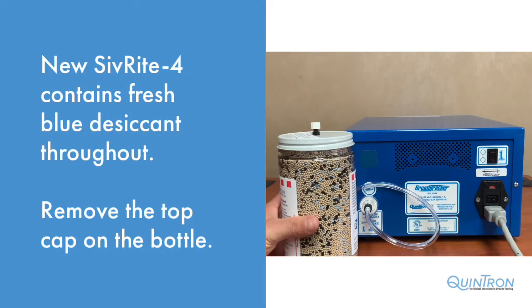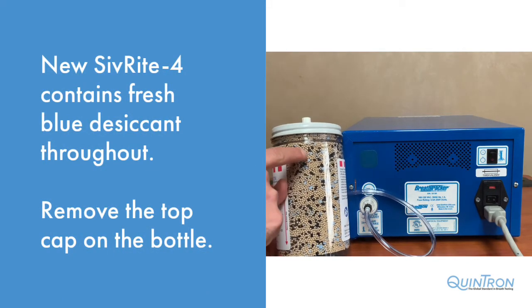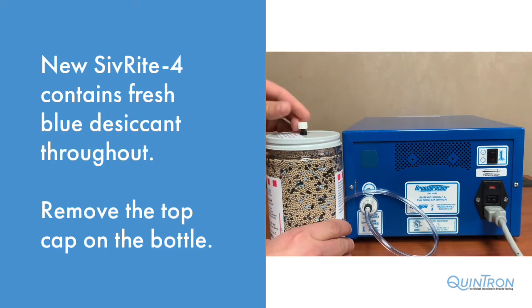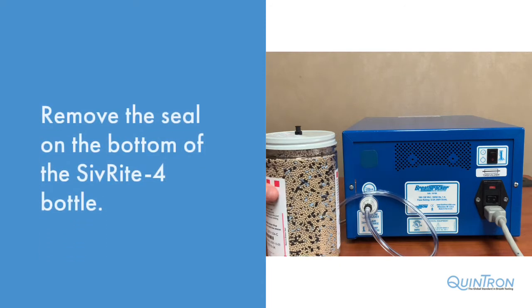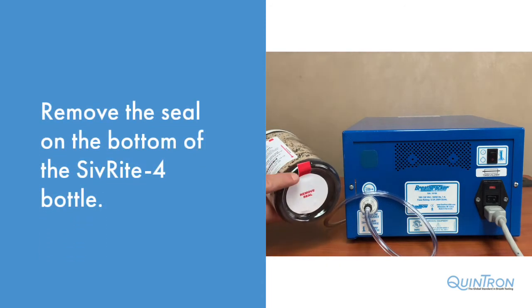As you can see with a new Sivrite 4 bottle, the desiccant material within is blue throughout. Remove the small cap on top of the lure of the Sivrite 4 bottle. Then remove the seal located on the bottom of the Sivrite 4 bottle.